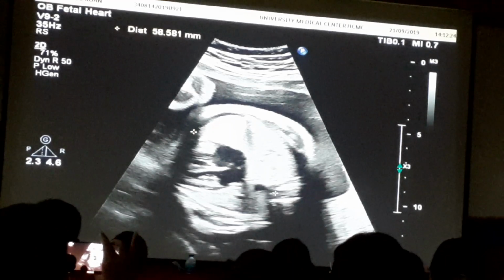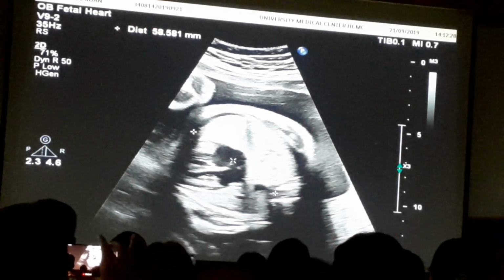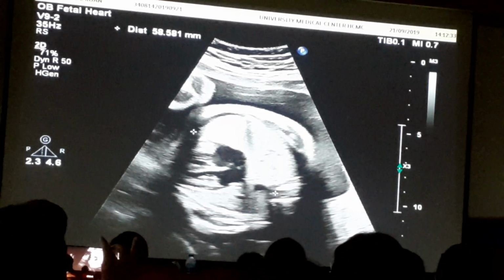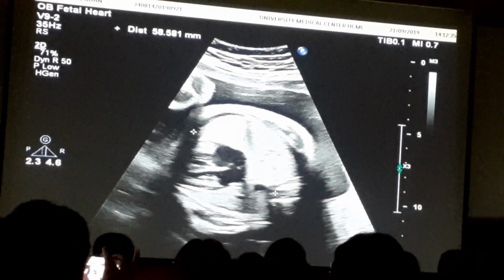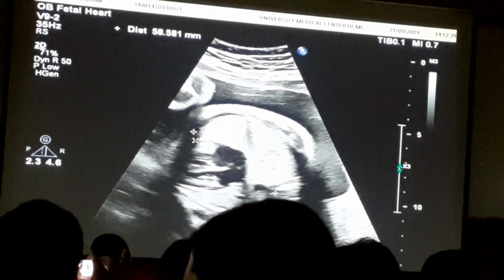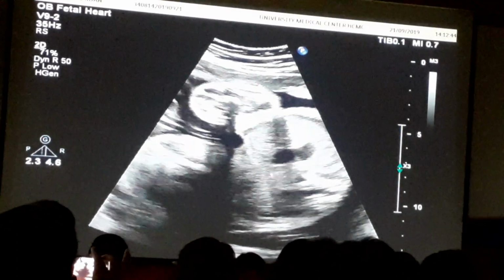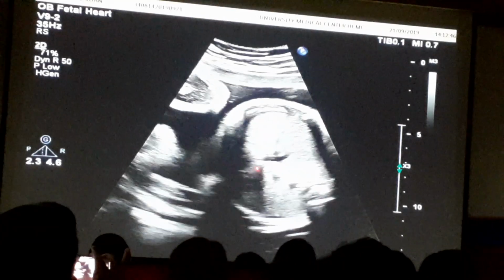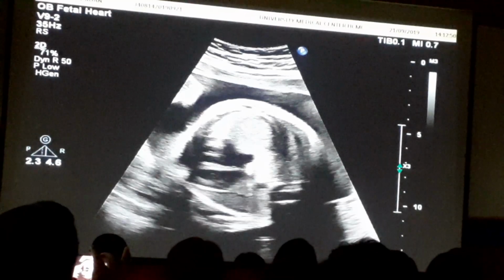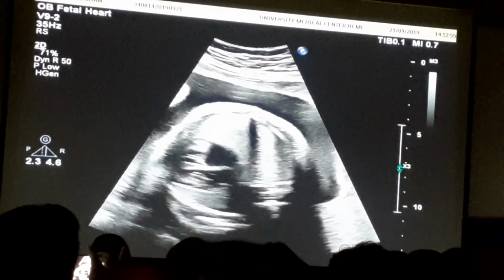Still didn't do it. What I'm trying to illustrate is that it appears that the heart is a little bit more in the left chest than would be normal, and that we're seeing quite a bit of right lung here, much more so than we normally see. Ở đây mình vẽ một cái đường chủ yếu là để cho các bạn thấy là cái tim có vẻ nằm về phía bên trái nhiều hơn là bình thường. Ở phía bên phải mình nhìn thấy nhu mô phổi nhiều hơn.